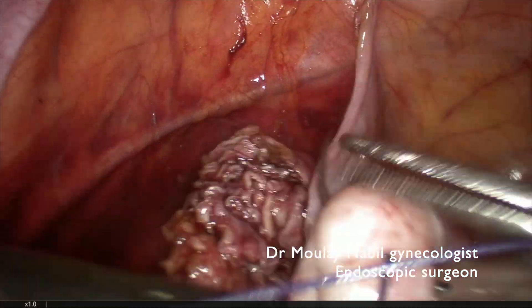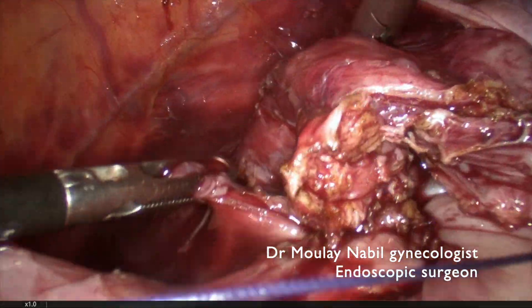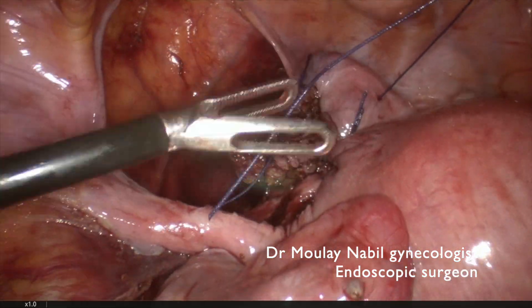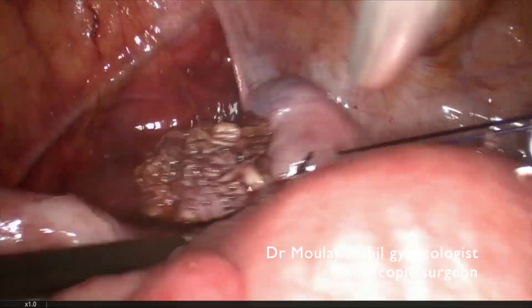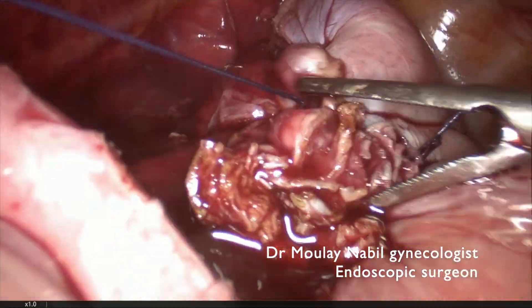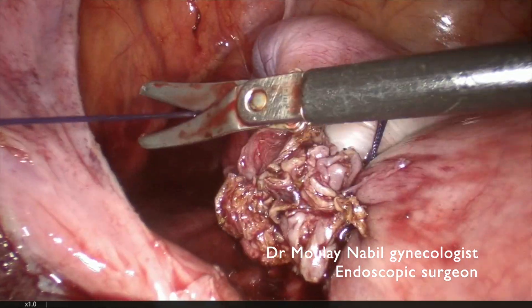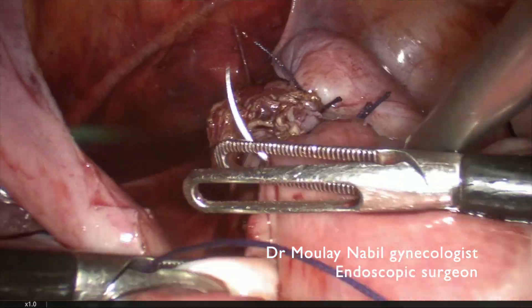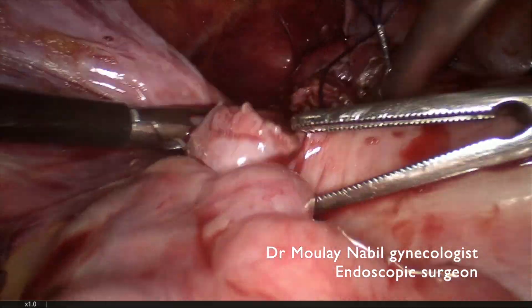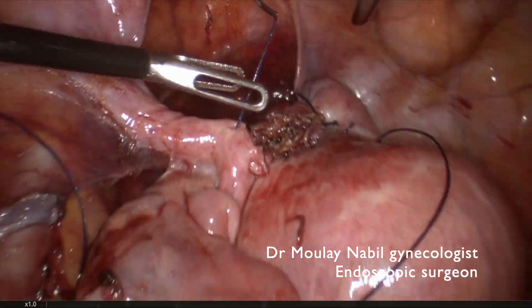We continue the closure — the same maneuver, 2 cm outside the myoma bed — and we close with interrupted sutures. It's crucial to do a flat knot for a perfect hemostatic effect. You can see the assistant locks the knot and we do two or three loops.